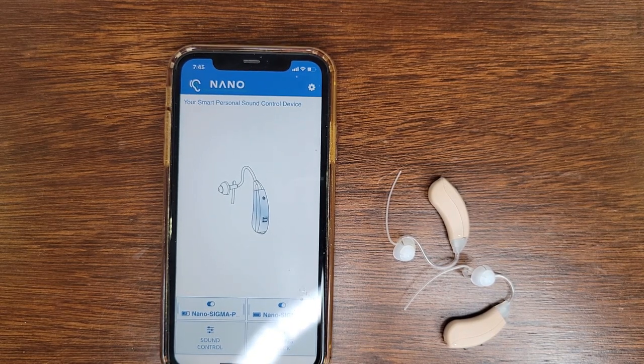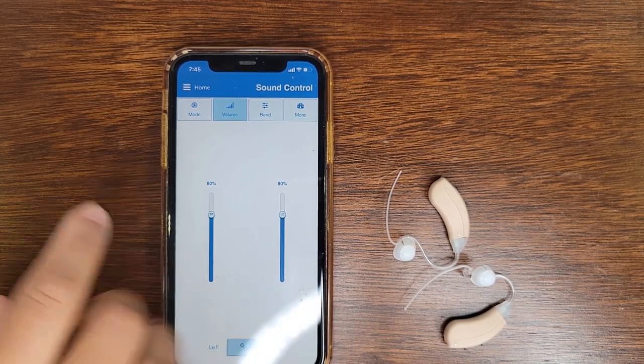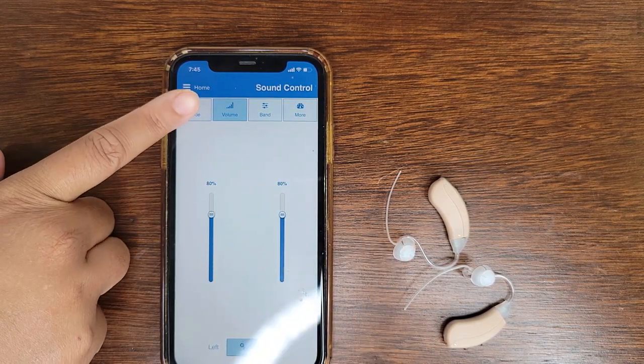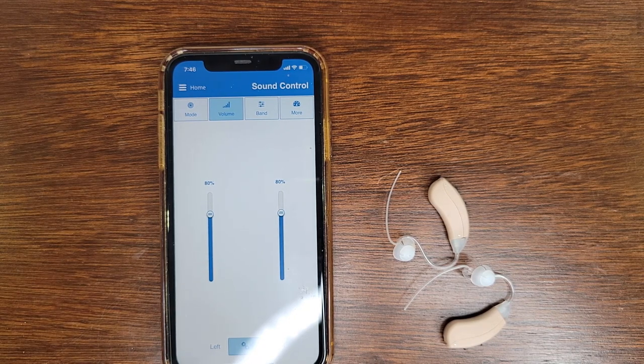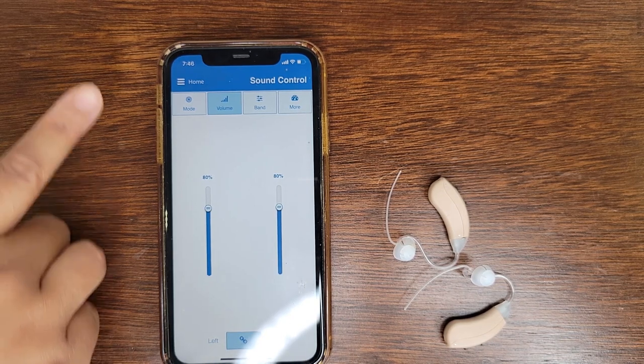And now on the home, the other button that I wanted to show you is the sound control tab. So let's click on that. And over here, you're going to see various modes, various tabs right here. So over here we have our mode tab, our volume tab, our band tab, and more. Right now, the left and right ear are linked. So if you adjust the toggle for the volume right here, they're going to adjust at the same rate, but you can unlink them as well.